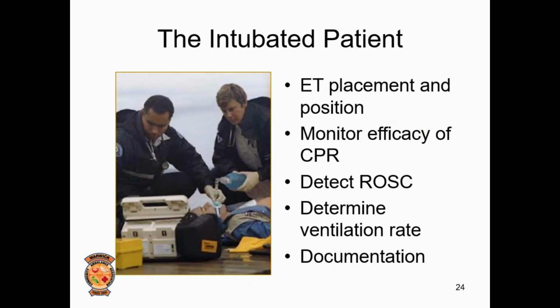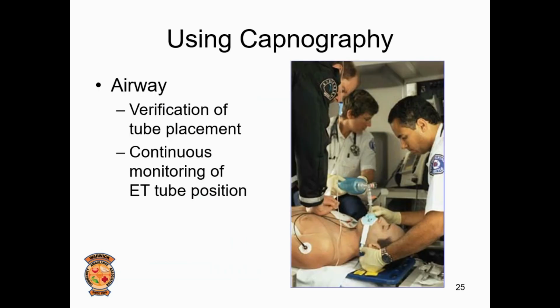Capnography plays a significant role in the intubated patient and specifically those in cardiac arrest. After intubation, a continuous waveform allows verification of ET tube placement. It also allows us to continuously monitor tube placement during movement and transport.